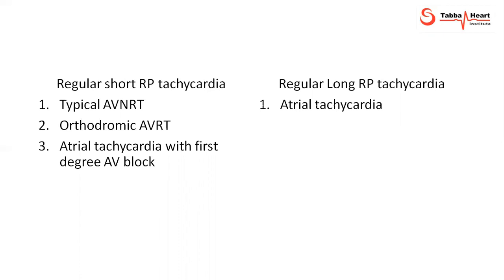I've not included junctional ectopic tachycardia in this because it's a very rare diagnosis, usually seen in young children.